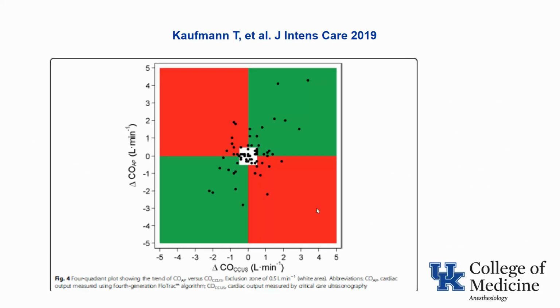And even trending, all of the trends should be, of course, in the green box, but there are notable exceptions when the two devices went in opposite directions. So not acceptable in seriously ill patients.